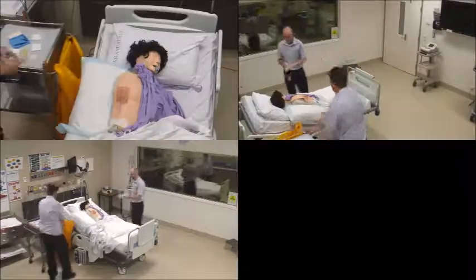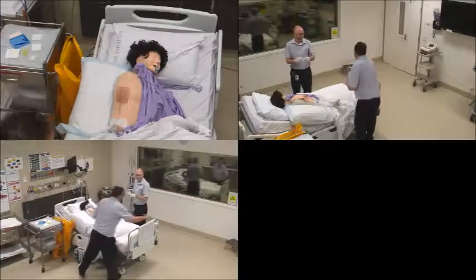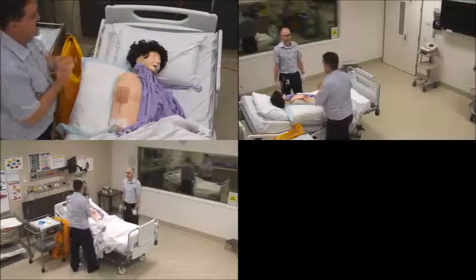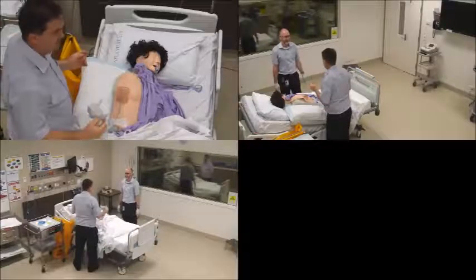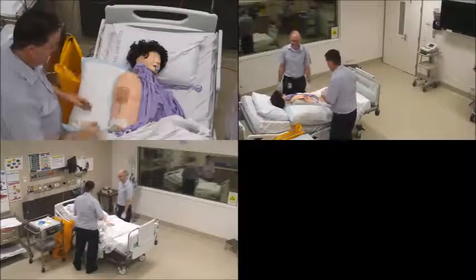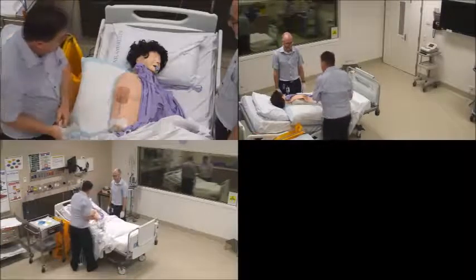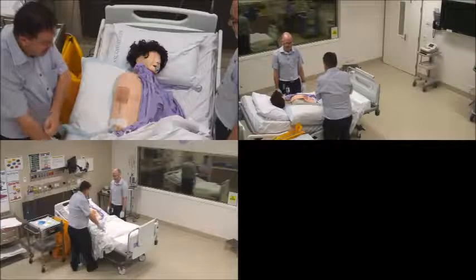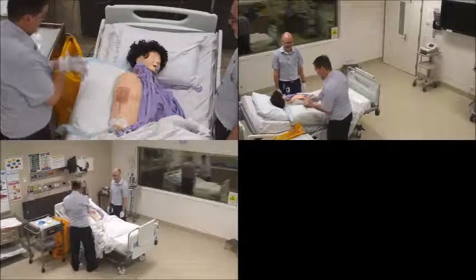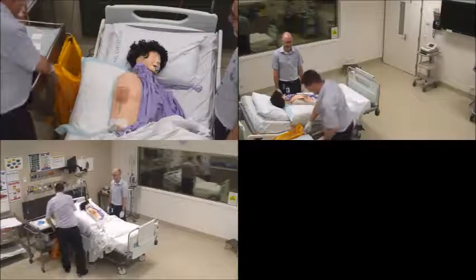Dressing trolley. Scott, are you comfortable there? Yeah. Okay, are you happy if we continue? Yes. So the first thing that we're going to do is take the old dressing down, and then we'll go and do our clinical hand wash and put our sterile gloves on. Okay? If you've got any questions at this stage, please don't hesitate to ask.